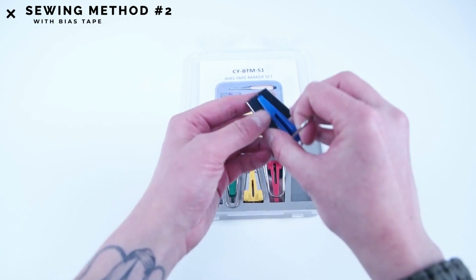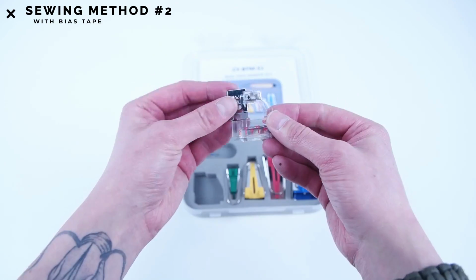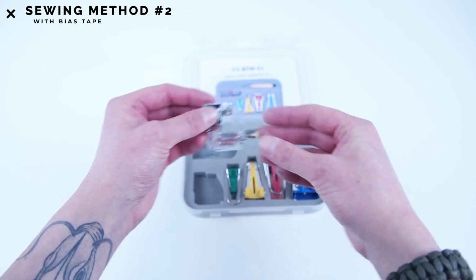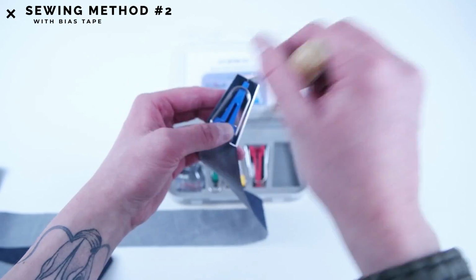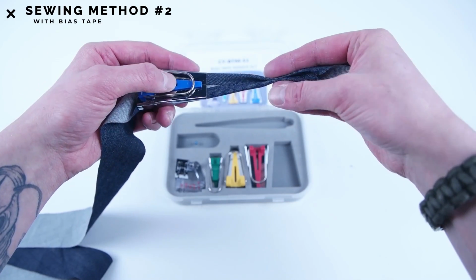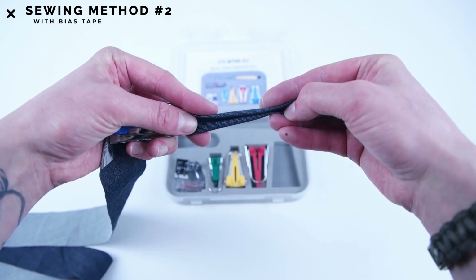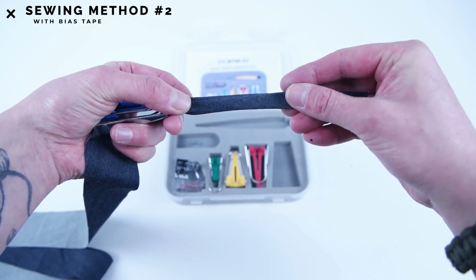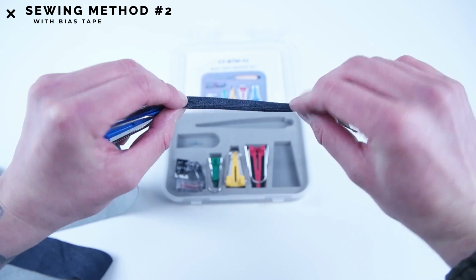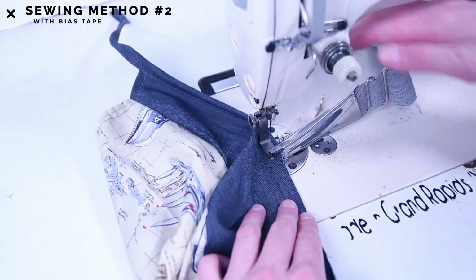It comes with a bunch of different size folders for whatever size you choose to use, and also a binding presser foot so it's super easy to sew on. And if you're using this method, cut your bias tape strip to the size folder you choose. Feed the strip through the folder and iron it as it comes out the other end. And as you can see, it's rolling over both the edges as it's coming out, so it's creating that double fold bias tape. And the third technique is to use a double fold bias tape binder attachment.